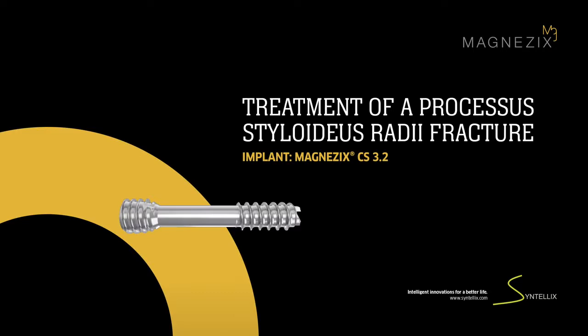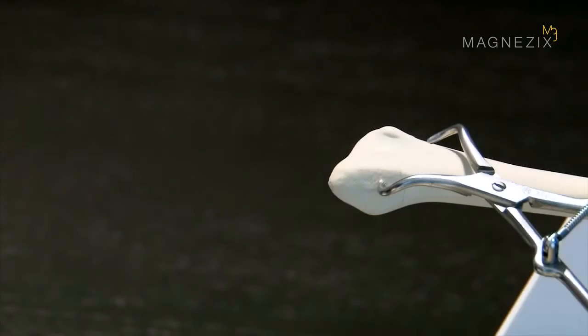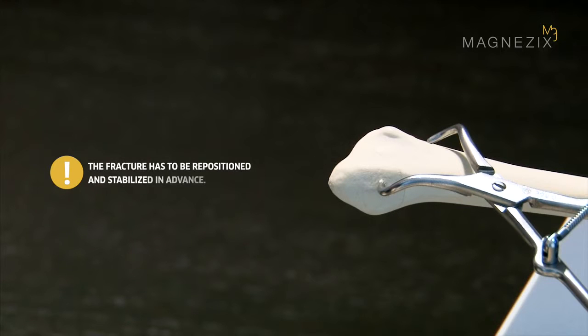This video describes the treatment of a processus styloideus radii fracture using a MAGNEZIX compression screw 3.2. Before the MAGNEZIX CS 3.2 can be implanted, the fracture must be repositioned and temporarily stabilized.